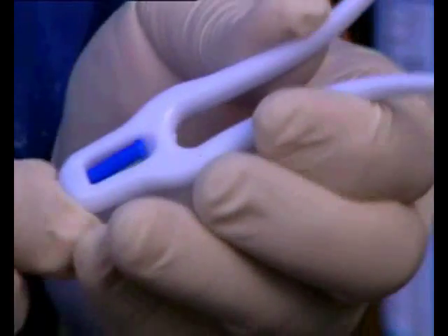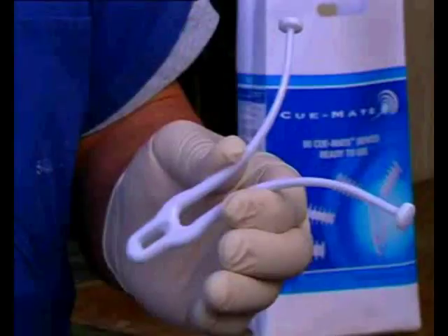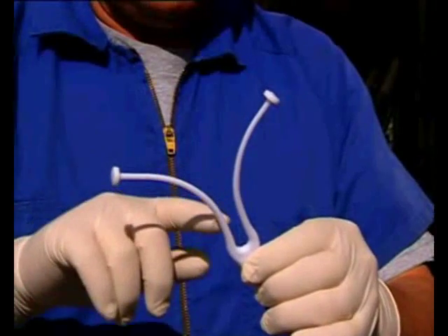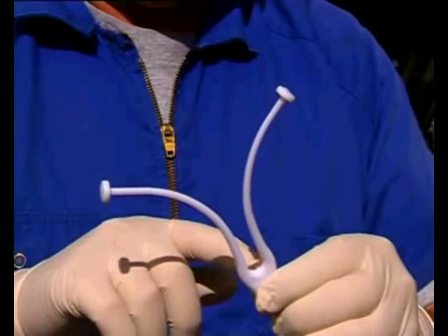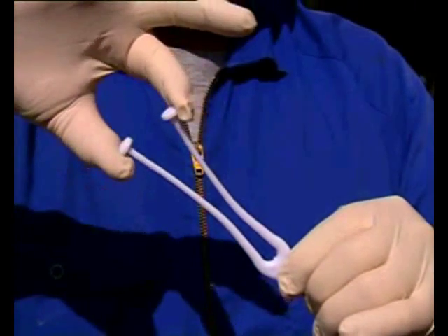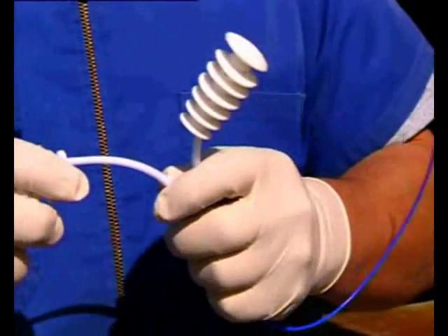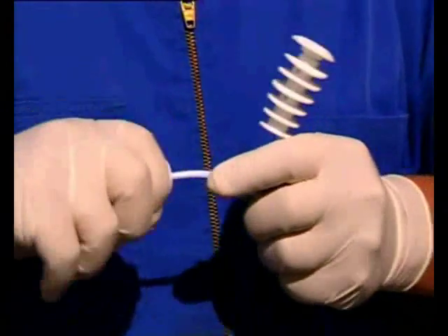The pods are attached to the wishbone, and after use they can be detached and discarded. The tail is also removed, which means the wishbone can be sanitized and reused. The wishbone carrier system is designed for cow comfort, with two S-shaped arms designed to flex while in the vagina. New pods can be attached to the wishbone carrier for reuse.